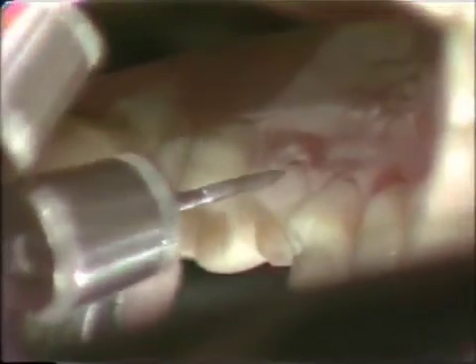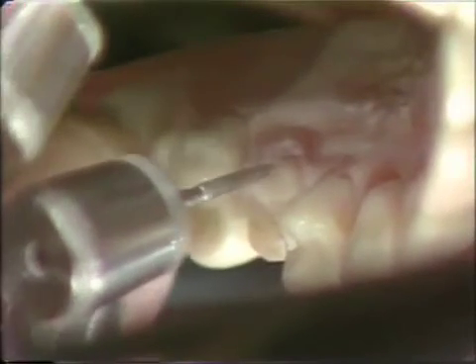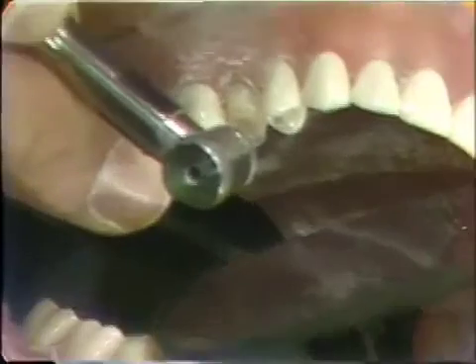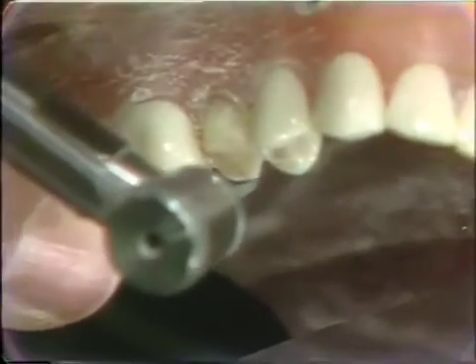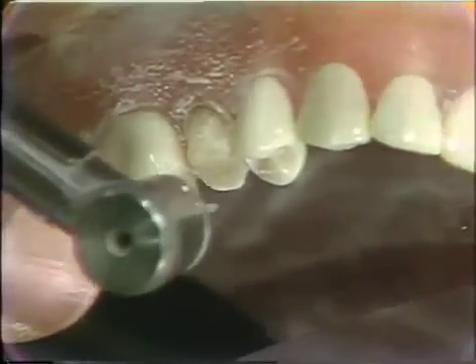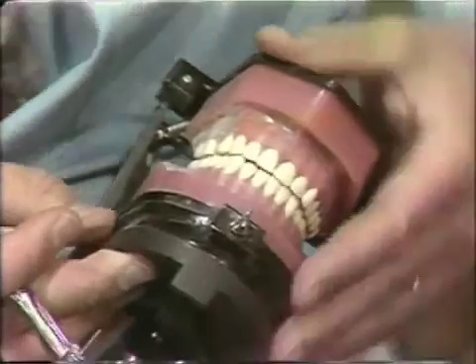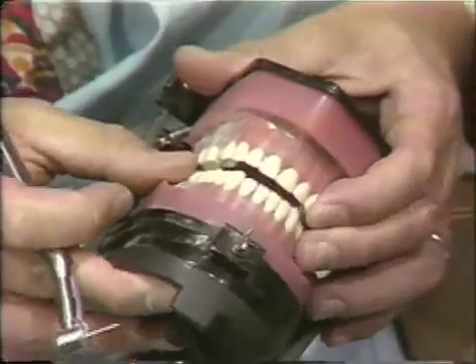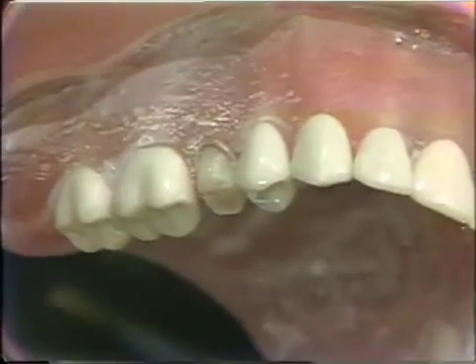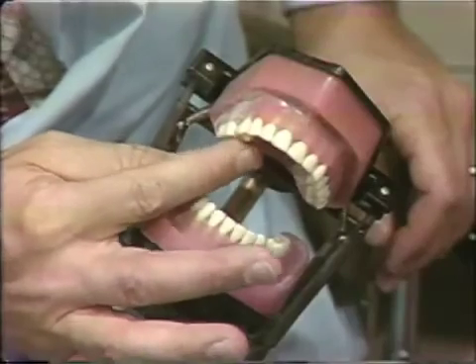We will round this lingual slightly and then check our occlusion by closing the typodon. We have 2mm of clearance in working and balancing. We seem to have pretty good clearance except for the lingual cusp, and to reduce that lingual cusp a little bit more we are going to switch to a WM1M diamond to reduce that slightly.